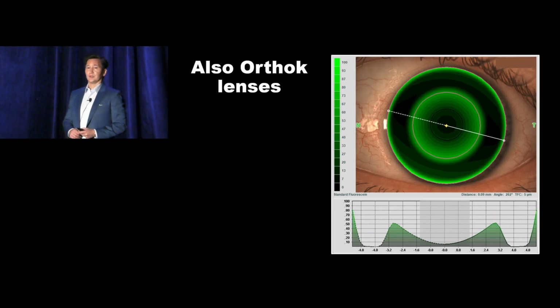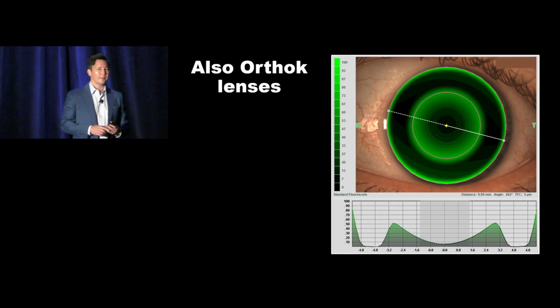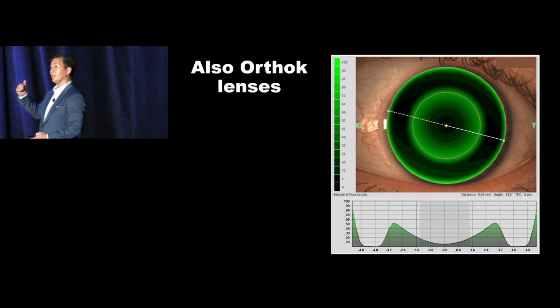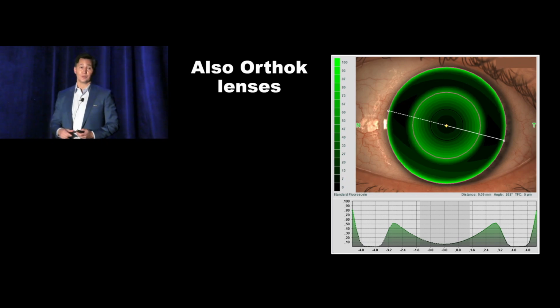So ortho-k lenses are really well designed from these contact lens softwares. I'm not suggesting you should do this right off the bat. If you're brand new to ortho-k, it definitely takes time to get to a point where you can manipulate this lens to have the right apical clearance, the right tear reservoir depth, appropriate alignment, healthy edge lift, all those things. But you might move yourself in the direction of getting control over all of those zones of the lens. And once you can understand the tear layer profile, you are an expert at orthokeratology.